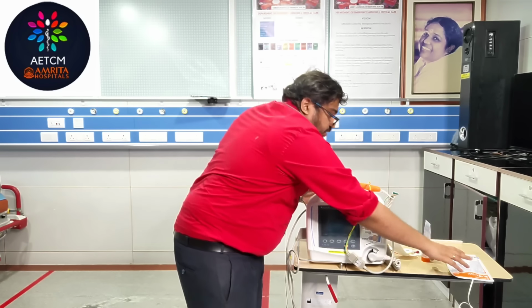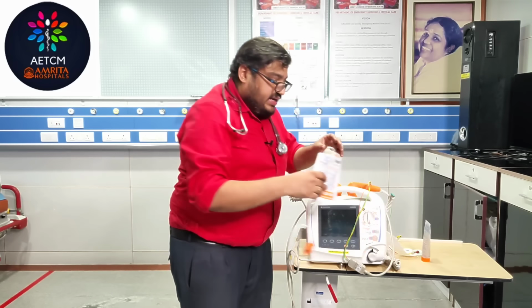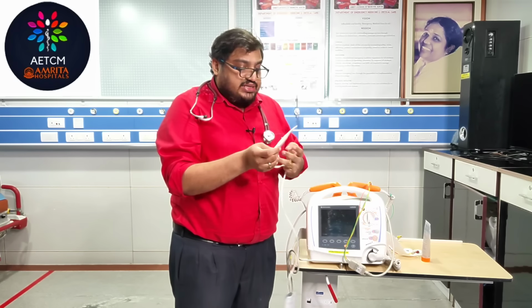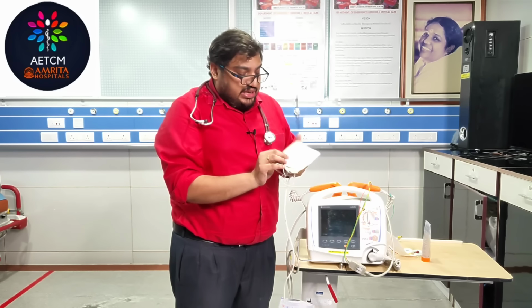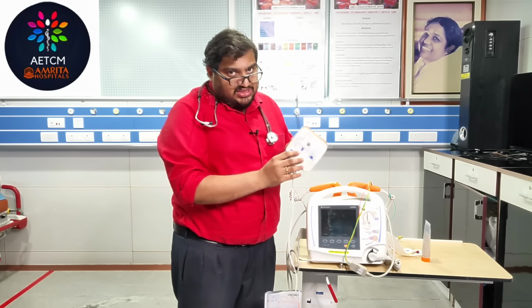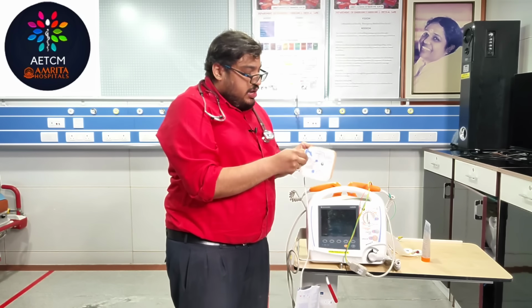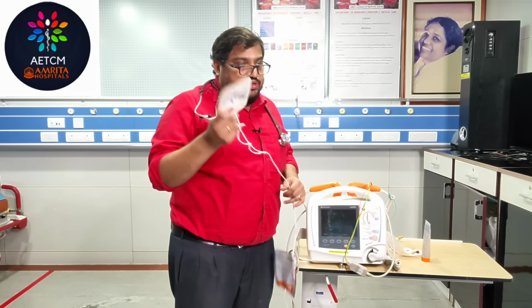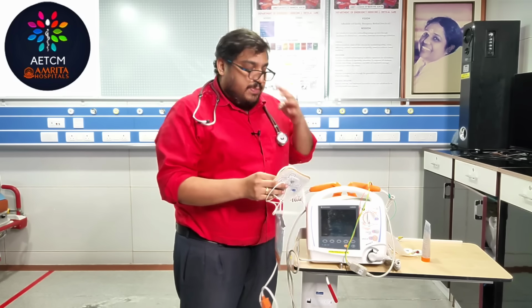In certain scenarios, in certain hospitals, you might see something called an adhesive pad. This is an adhesive pad. What you can see here in the image clearly, this is one to the front and one to the apex. If it is available, you can easily stick it on either side. There is no need for your 3 leads. You can use these adhesive paddles also.